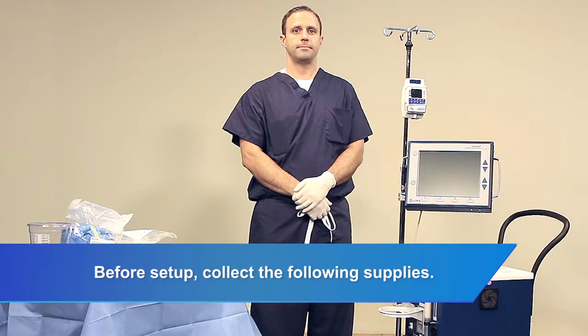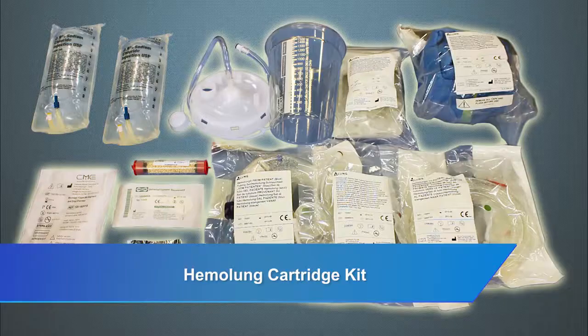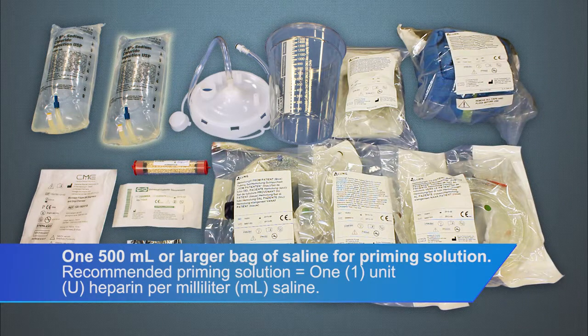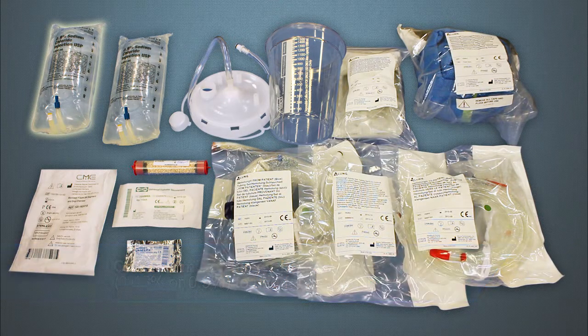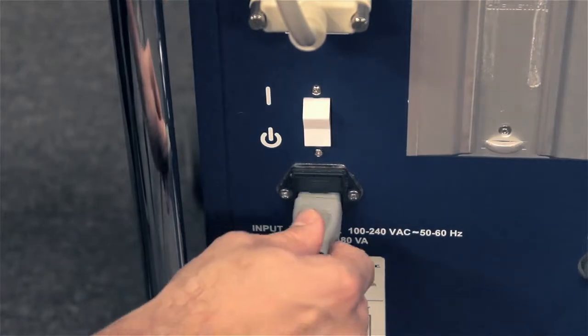Before set up, collect the following supplies: Hemolung Cartridge Kit, one 500ml or larger bag of saline for priming solution — recommended priming solution equals 1 unit heparin per milliliter saline — and one 500ml or larger bag of saline to use for seal flush.